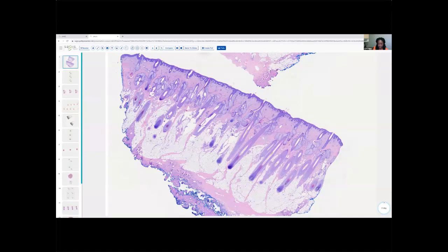The alopecias, we generally speak about scarring versus non-scarring, so that's the primary breakpoint. But again, there are some specific features that can help us delineate things a little bit more. Okay, so let's just jump into it here.